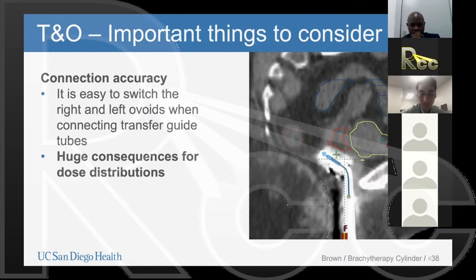We'll have to do another curriculum focused on external beam radiation. But you can certainly... This is Michael. I think you can comment on what we have seen, of course, in the past, doing this for a number of years. In our clinic, a patient may get radiation to the pelvis, including the lymphatics, and that is often 45 gray in 25 fractions, so at 1.8 gray per day. Sometimes it could be 50 gray in 25 fractions at 2 gray a day. And sometimes there's a parametrial boost involved. So that's at least the order of magnitude you will see, 1.8 or 2 gray a day times 25.